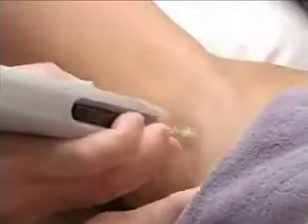That, of course, helps with the pain too. How painful is this? Not at all? And it's not hurting me a bit either, so we're both good. This is a very fast procedure — we're getting the size of a dime every one second if we want to. We can go real fast, but we usually go slow. There's no time to hurry, no reason to go fast.